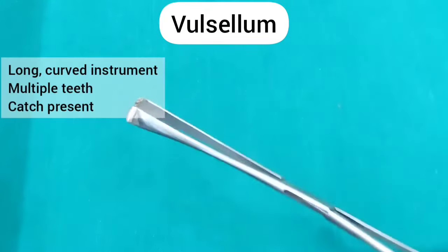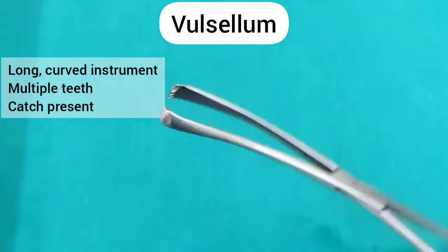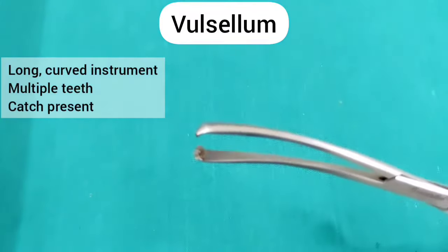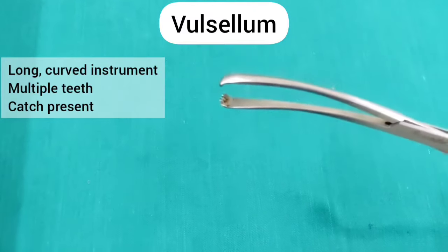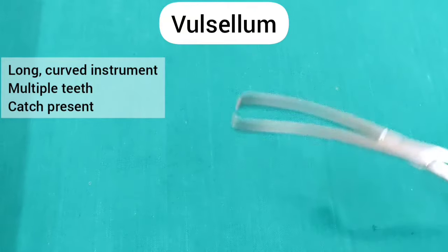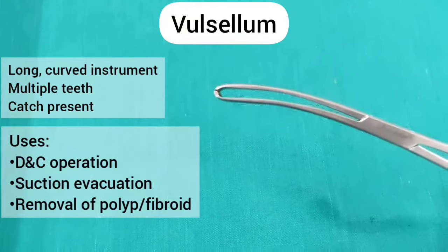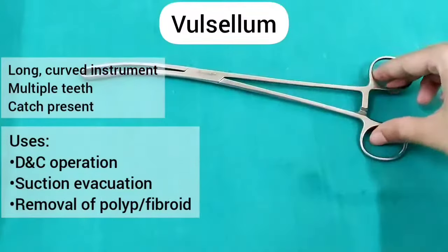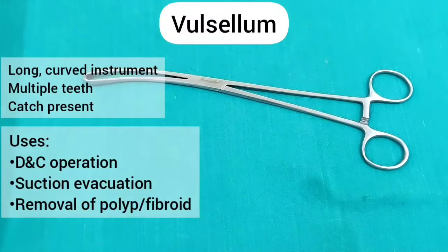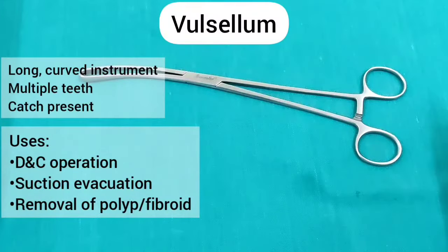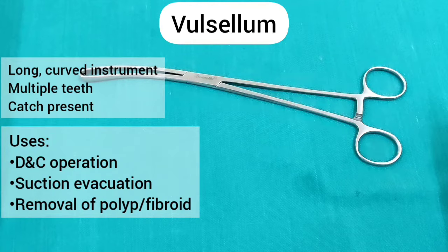This is a multiple tooth vulsellum. It is a long curved instrument. You can see the multiple teeth on both the blades. It has a catch. It is used in D&C operation, suction evacuation, and in the removal of polyp and fibroid.